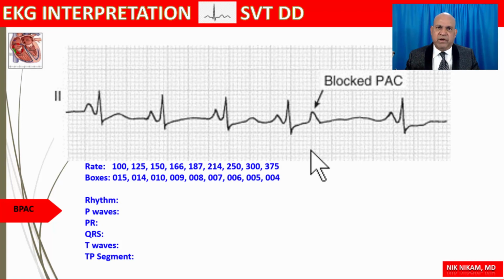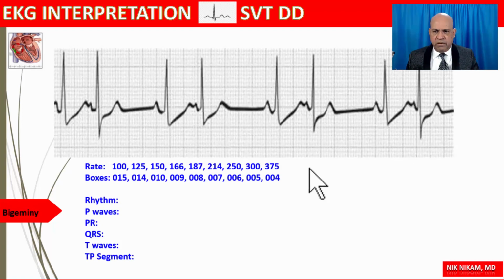But I want to emphasize more importantly the differential diagnosis every time we are talking about a given rhythm, so that we understand this from multiple angles, not just focusing on trying to make the quickest and the most accurate diagnosis. Okay, take a look at this and see what your diagnosis is.